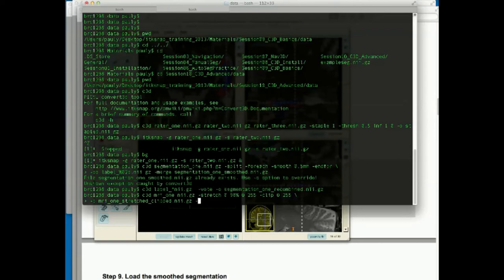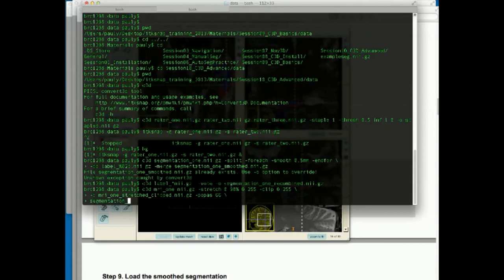So now we are going to store it away. We're going to use it later. As Phil said, with pop you can pop an image out of the stack, but in this case we are not only popping but we are remembering it as a shortcut. So you're popping and at the same time you're giving it a shortcut, which is GG. Then we're going to load the segmentation. Again, just reminding you, we have a gray image, we already have the segmentation, we want to produce those nice little chunky images in the end.